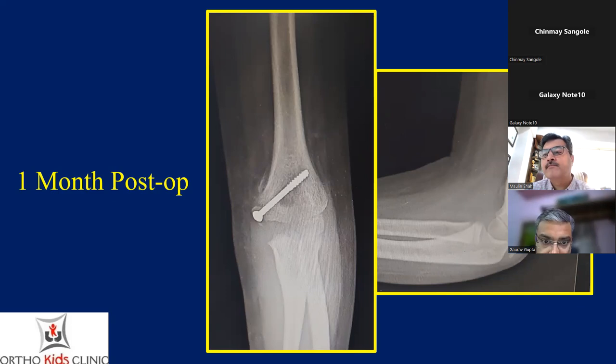Sir, hello. We can add one more view in this. There is an axial view for the distal humerus, which can show the actual displacement and the rotation. This was a paper from Dr. Edmonds, I think. Rather than going for the axial view, how they take it is a 45 degree oblique. I can share the paper in our group. They compared normal X-ray, CT scan, and the axial view.